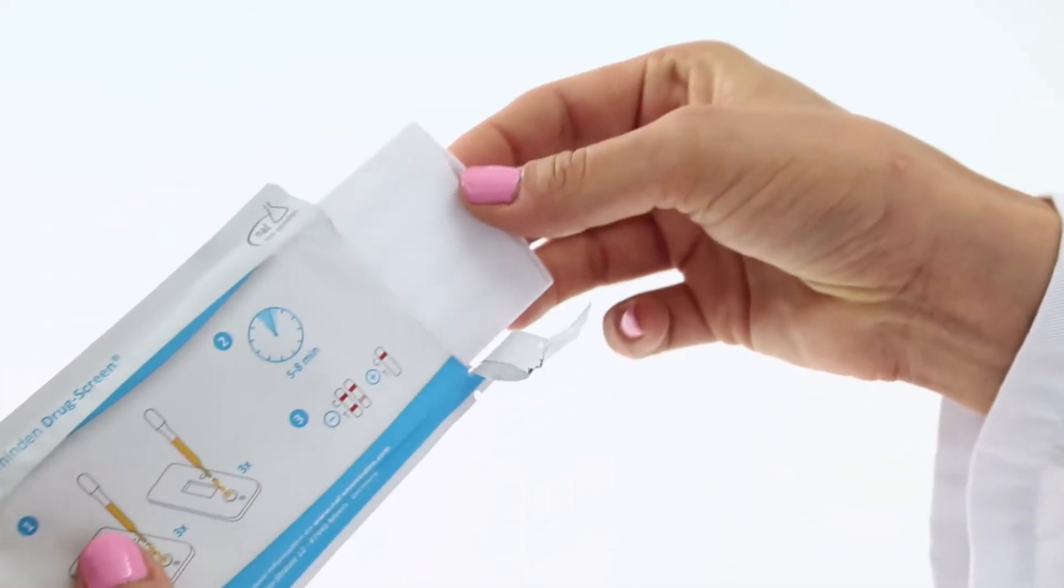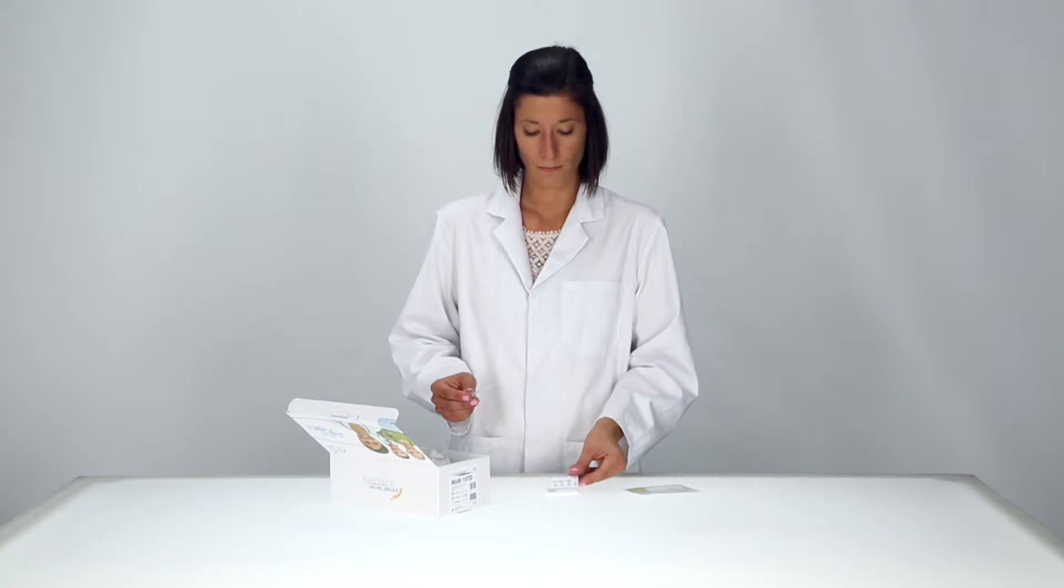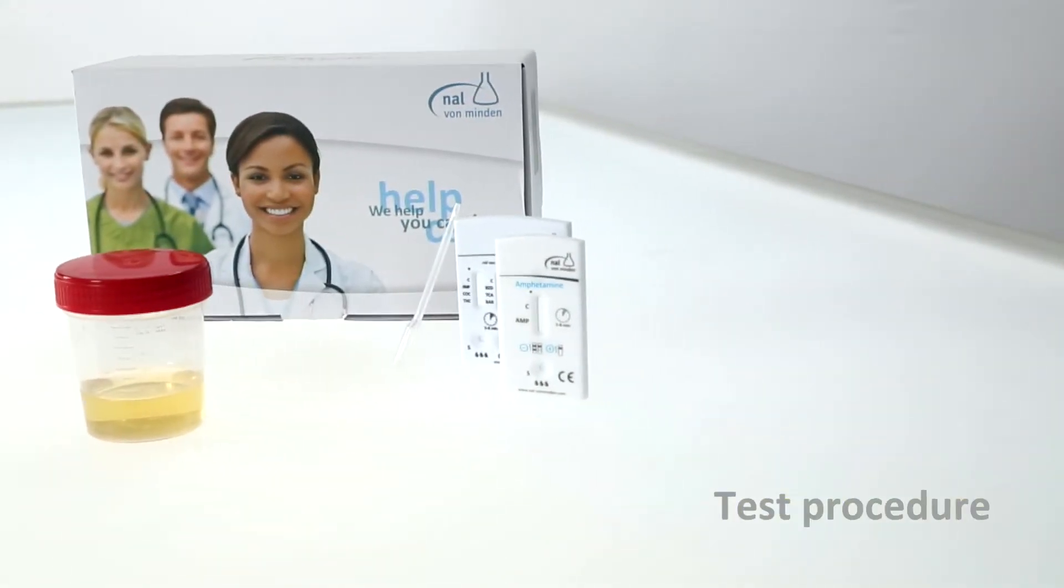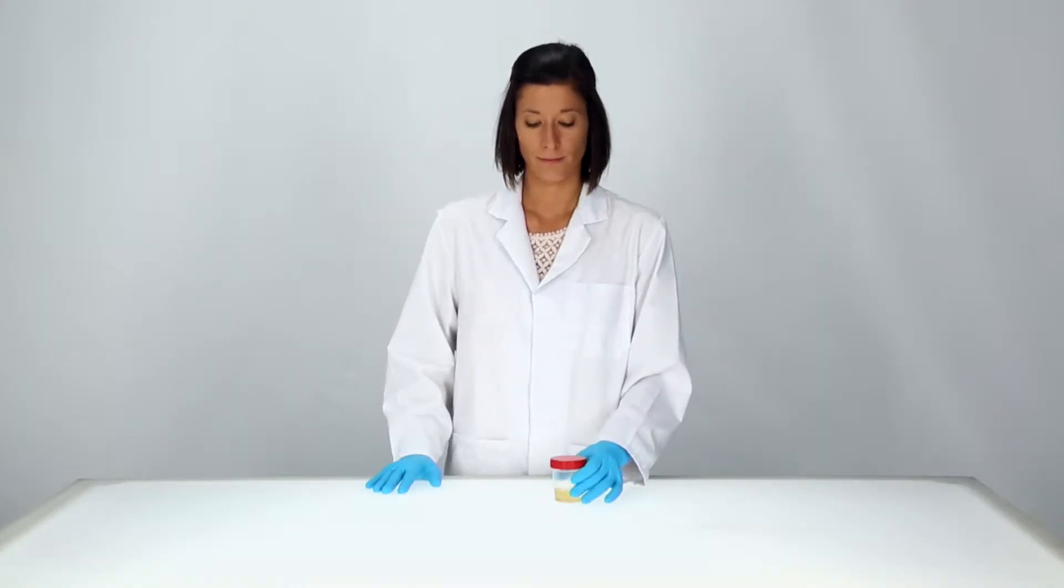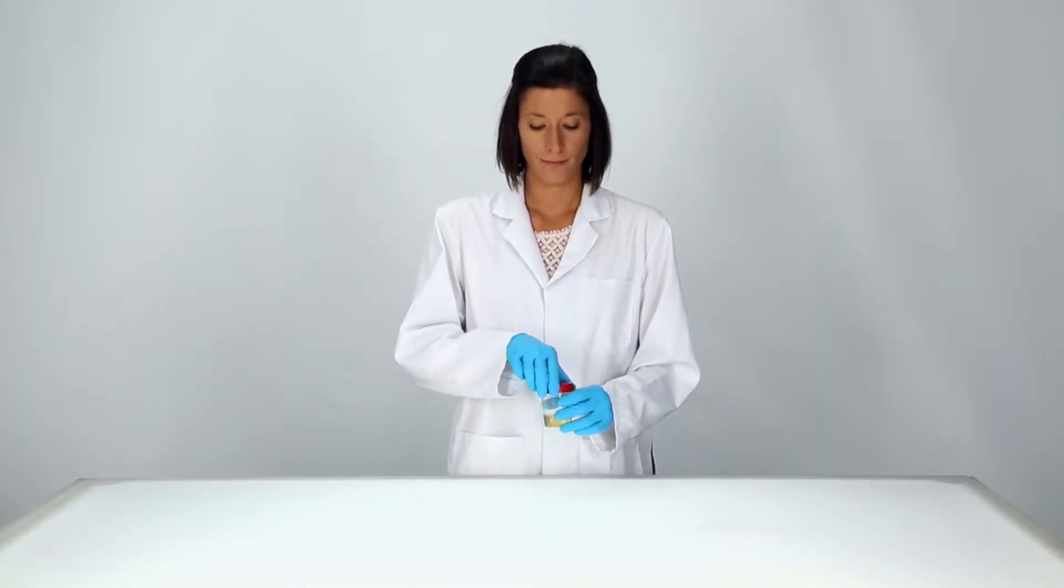Use the test immediately after removing it from its pouch. Collect the urine sample in a clean and dry sample container.